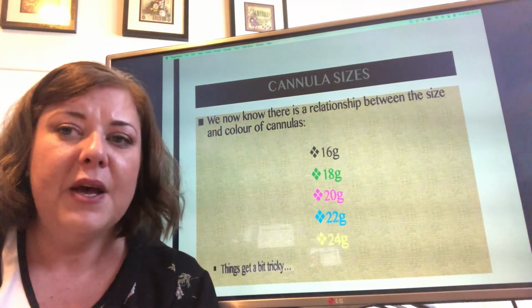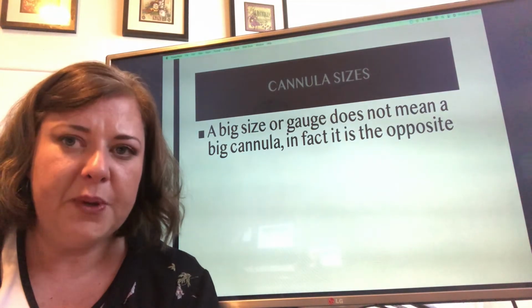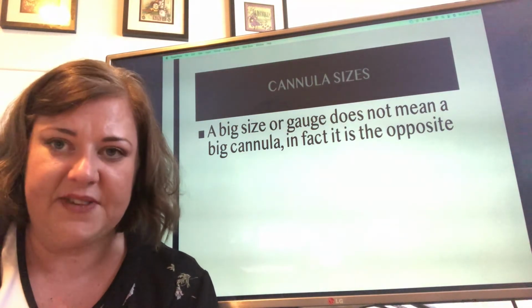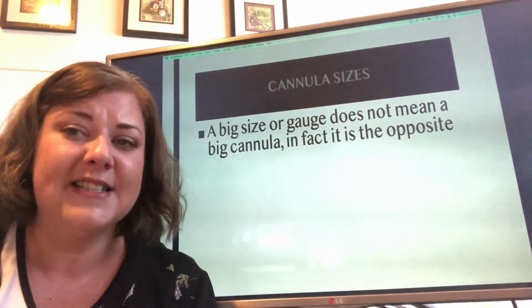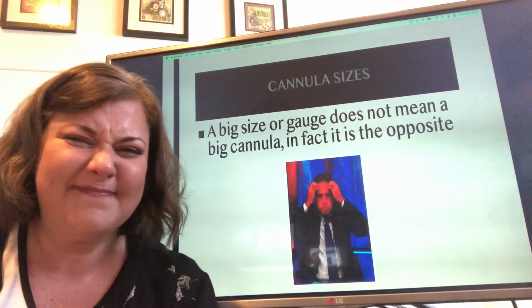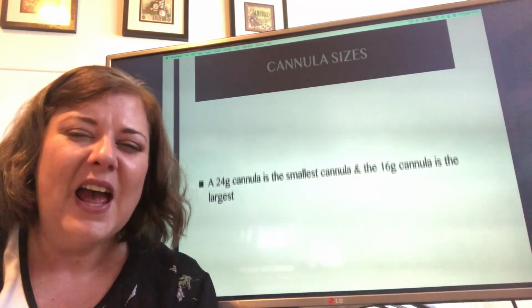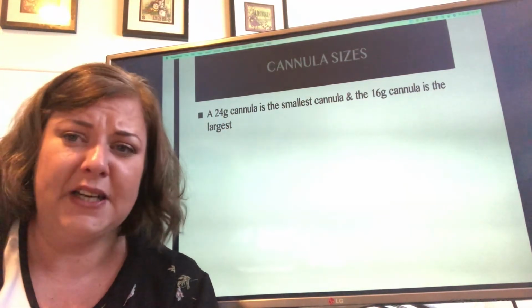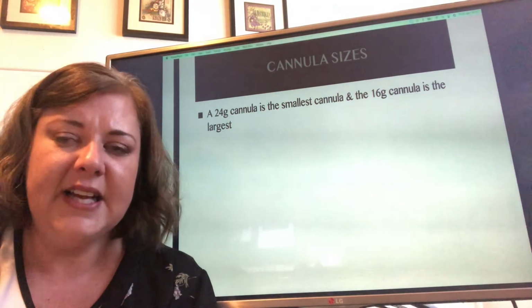Easy said, but this is where things get a little bit tricky. That's because a big size gauge or size of cannula doesn't mean it is a big cannula. In fact, it's exactly the opposite. Not helpful. So a 24 gauge cannula is actually the smallest cannula we have, whereas the 16 gauge cannula is the largest.